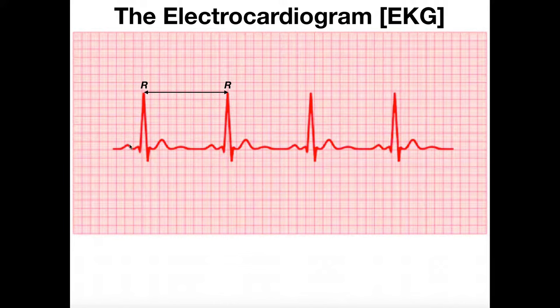So first of all here is a P wave, this is the QRS complex, and then here's a T wave — and all that is representative of one cardiac cycle. Here's a second cardiac cycle over here, and so if we want to estimate a patient's heart rate we first have to calculate what's called the RR distance between the QRS complexes of two different adjacent cardiac cycles.